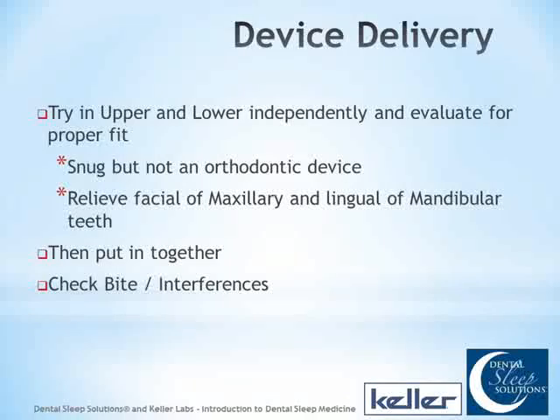One other little pearl I'll throw out there too is if you have an upper tooth that is pushed out towards the facial. A lot of times you'll see lateral incisors where that mesial line angle, mesiofacial, is pushed out towards the facial. A lot of times I would just take and adjust that corner. So on an upper tooth it would be something that's too far facial, and on a lower tooth it would be something that's too far lingual.